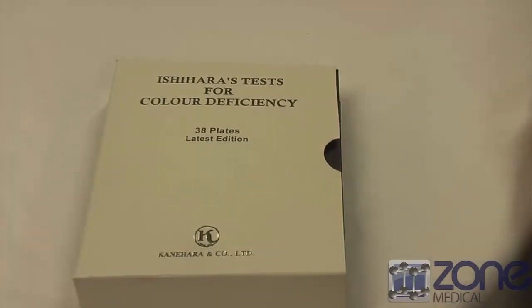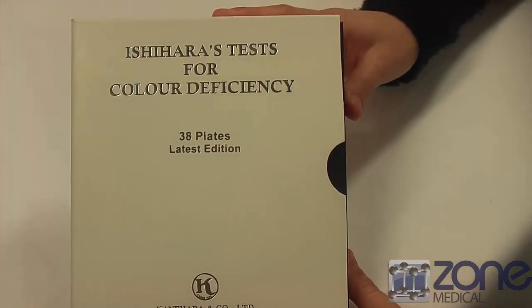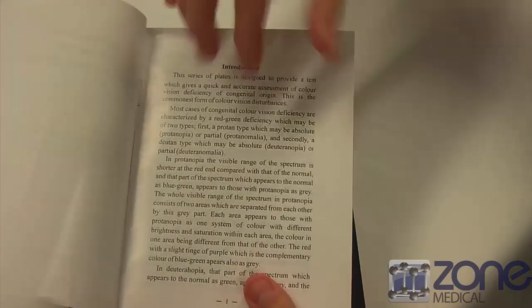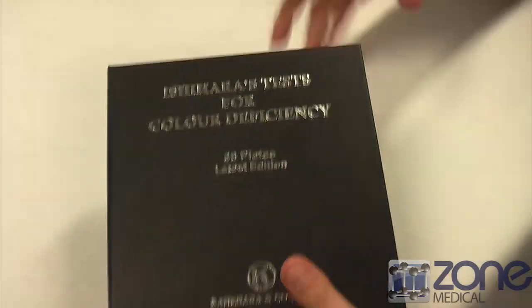Today I'm going to be showing you how Ishihara's tests for color deficiency work. This is the cover here, and once you open it up, here is the book. It comes with a little manual with all of the findings and everything that your patient needs to know about their color deficiency in their eyes.